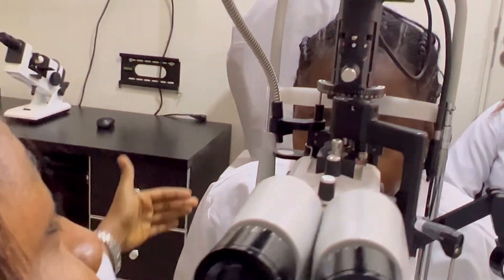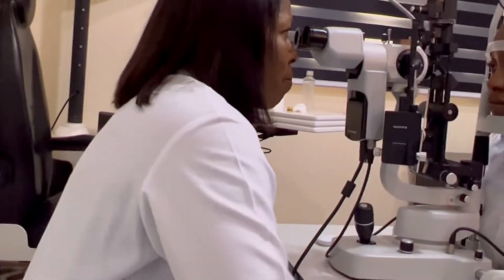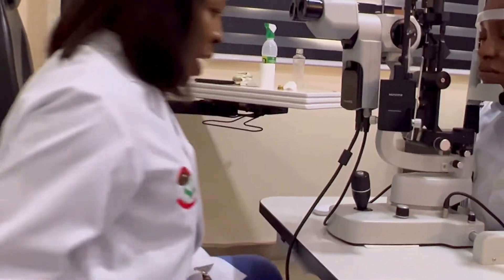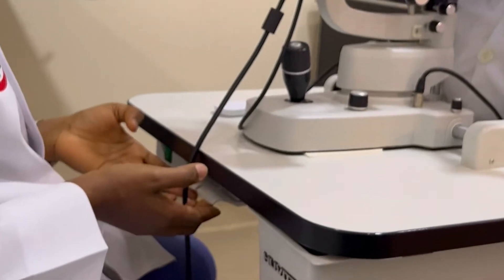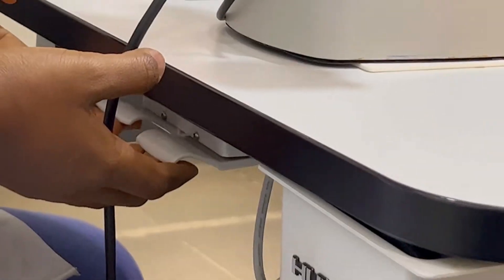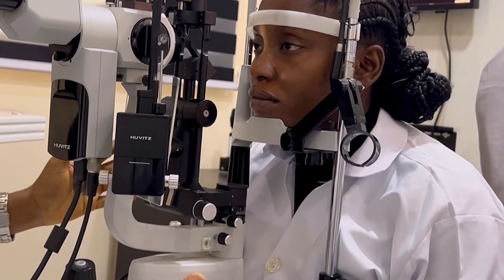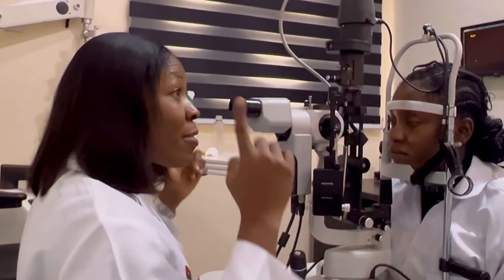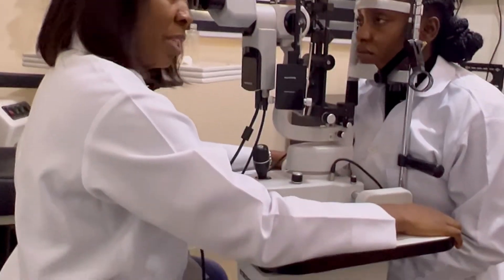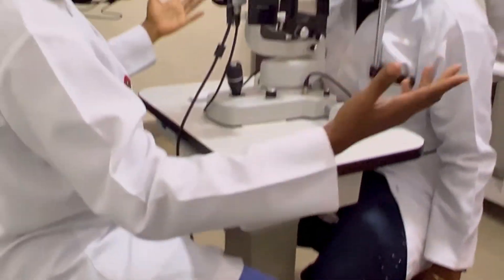The next thing is to check whether the patient's back is straight, because we don't want the patient to be arching. You don't want the patient to be stretching their neck or have an arching back — it should not be bent. To prevent arching of the patient, you use the table adjustment lever, which serves to take the patient downward or upward. Take the table lever upward, making sure she's not arching. This is how your patient should be properly set for slit-lamp biomicroscopy. Neither the patient nor the clinician should rest their hand on top of the table, nor should you knock the slit-lamp biomicroscopy table.